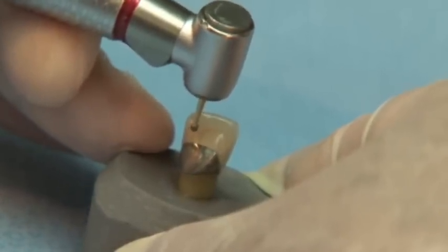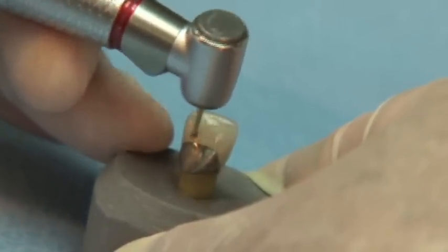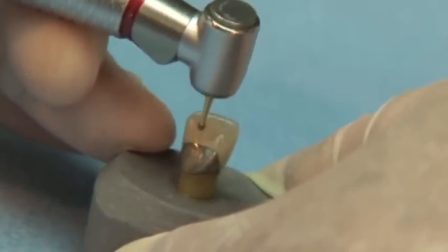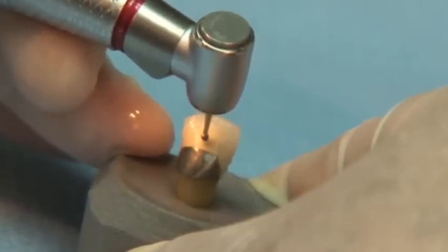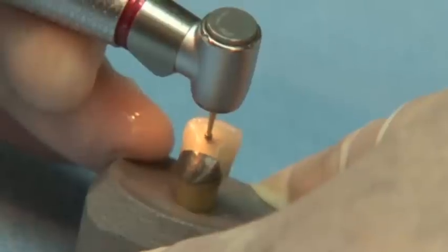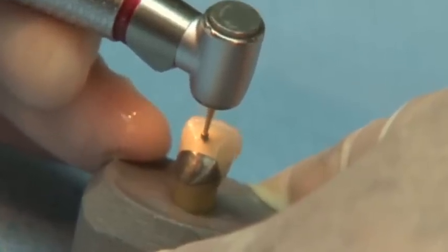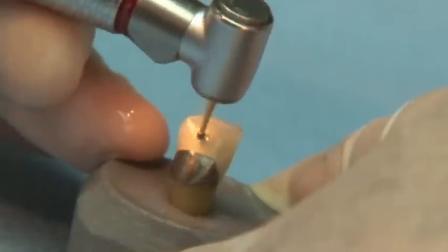Creating proper access for endodontic treatment requires the use of a burr that has the ability to cut through porcelain, composite and metal. The Great White Series Carbide Burr is designed to cut through porcelain fused to metal crowns without shattering the porcelain or breaking the burr.